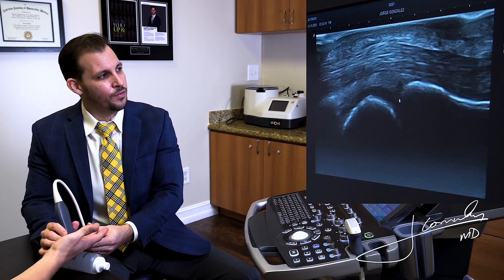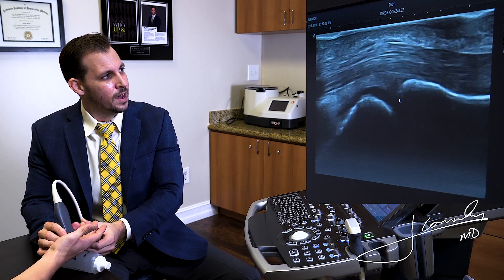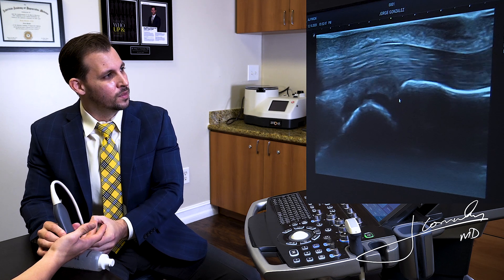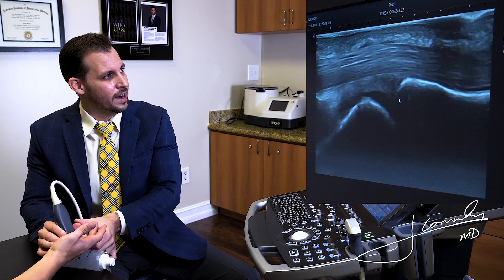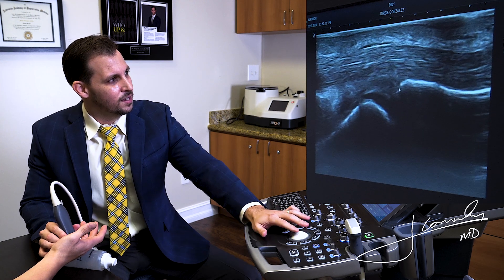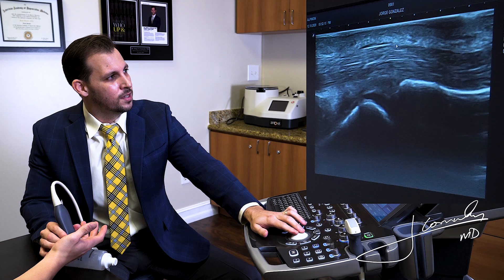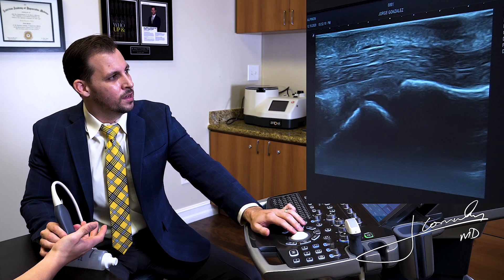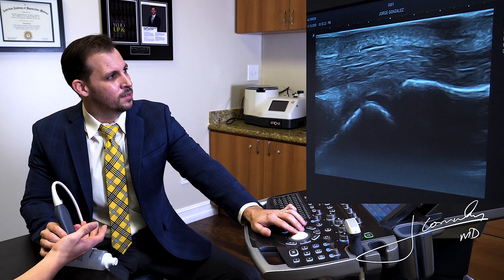What I'm going to do is actively flex the finger so we can see the tendons moving nice and smooth. Again, this is an intact or normal patient — he does not have trigger finger. What we're concentrating on right now in long axis is the A1 pulley, which is this hypoechoic line right on top of the flexor tendons at the level of the MCPs.